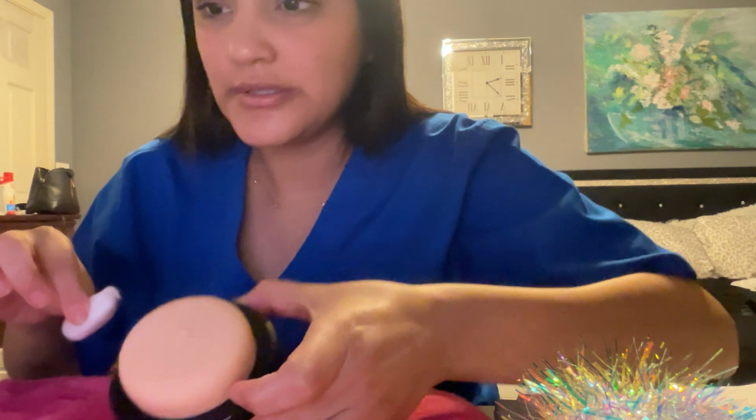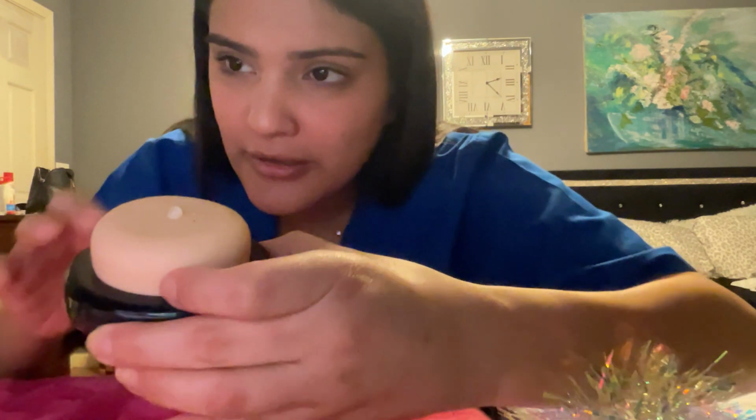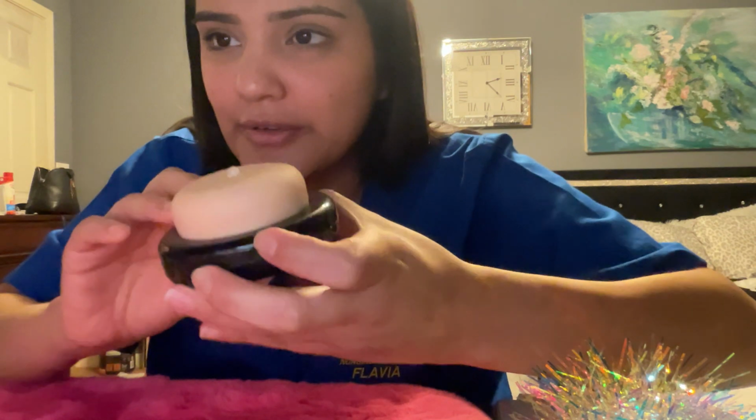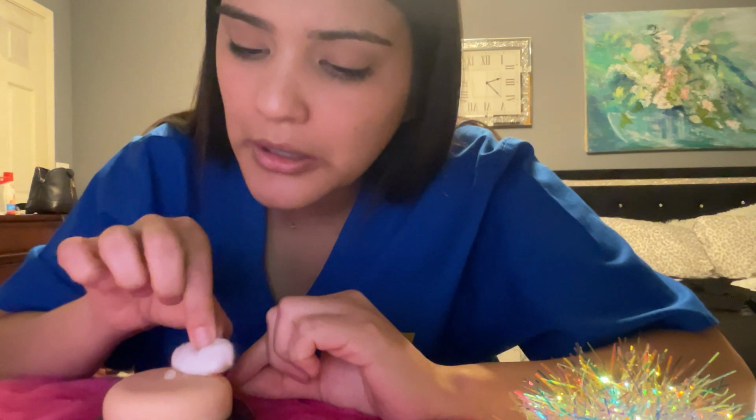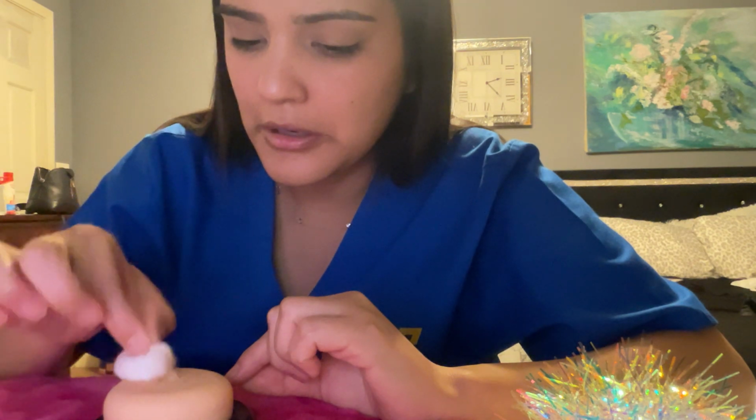And you want to gently pat. So here, you can see it, right there. Okay, and then you just want to pat it gently, just like that. You wouldn't want to massage the area because you're trying to see the effects that it has on that skin with this test.